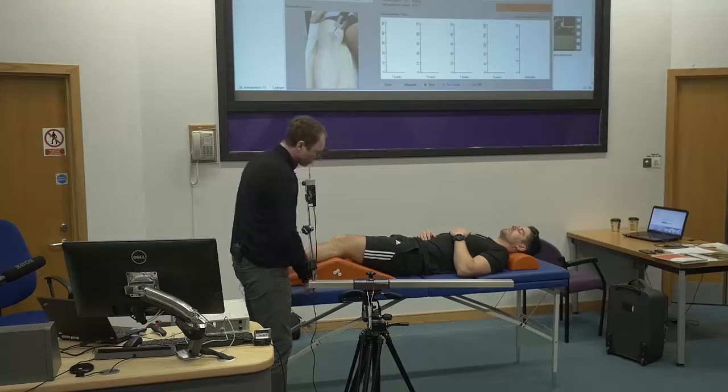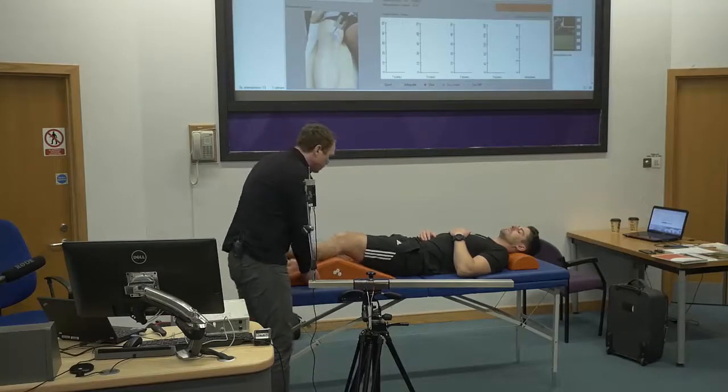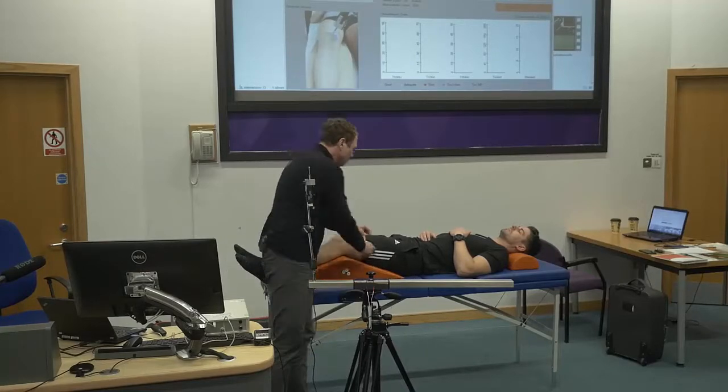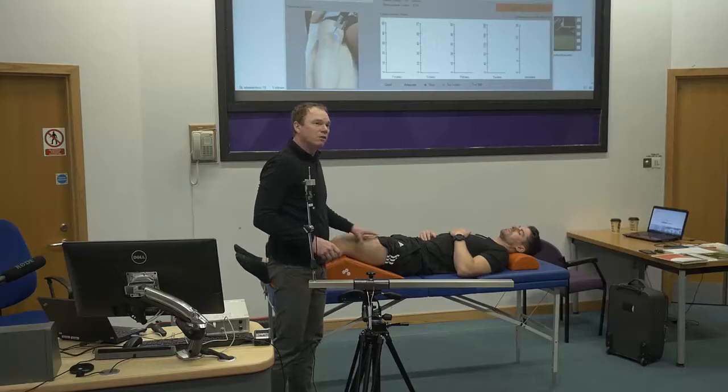You don't want to see a position like that. It wouldn't affect the results much, but you try to make the subject in a position in which the muscles that you're measuring are really, really relaxed.